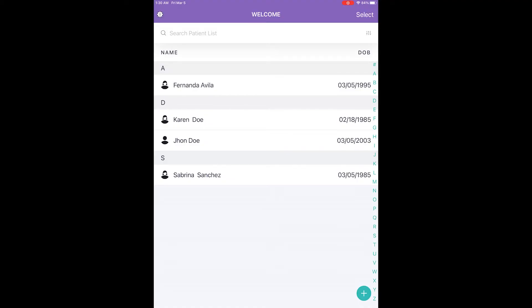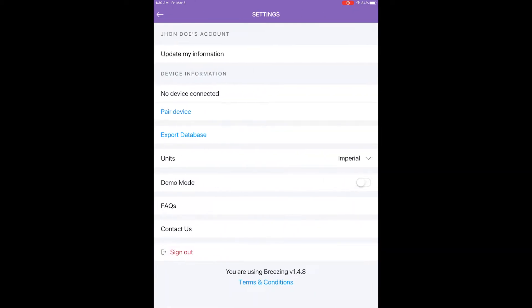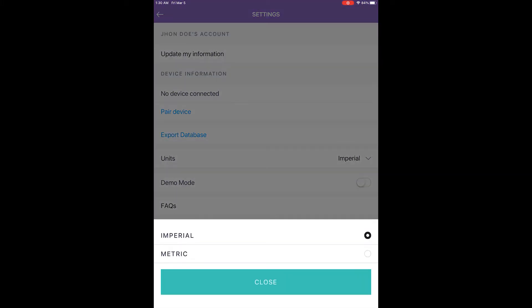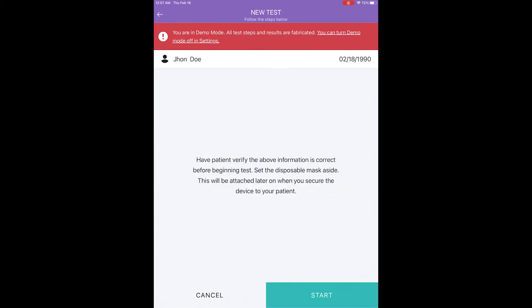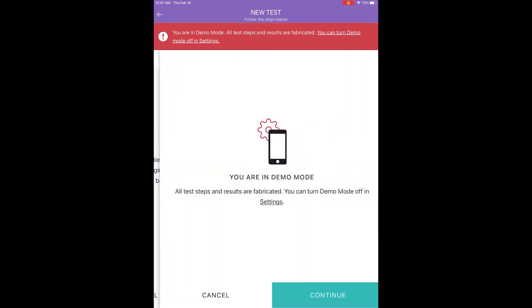Step one: Select Patient. Once you have signed into your professional account, tap plus to create a new patient, or scroll or use letters to navigate the list of patients and find your patient. Also consider tapping the gear icon in the upper left to modify your user information, measurement units, or other global app settings. You can run the Breezing app for demonstration purposes by selecting demo on in settings; this will walk through the app and simulate measurement results at the end of the demo.